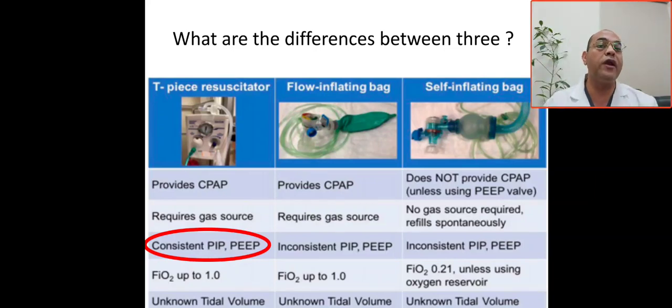All in one. It will be all in one. The second issue in the ventilation, pressure and volume: all will give unknown tidal volume. So we'll go one by one.